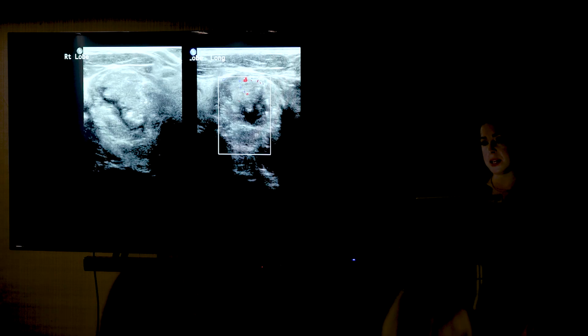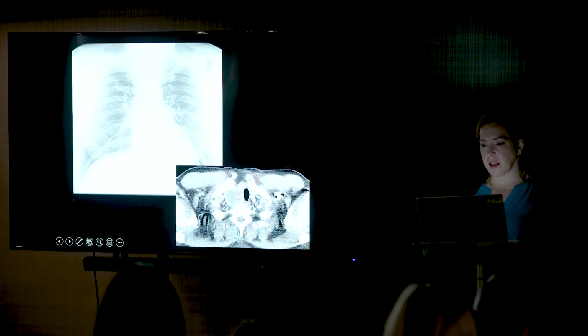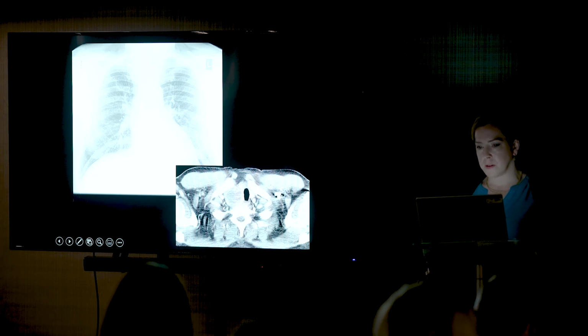So case 20, this nodule is the one in question. It has a cystic cleft, but quite irregular in the centre, some vascularity, and then echogenic foci. So what U grading would we FNA? And that's the CT that goes, plain film again, trachea deviated to the left there, and the CT scan shows you can see calcification on the CT as well.